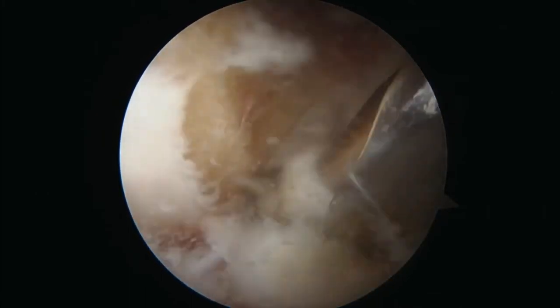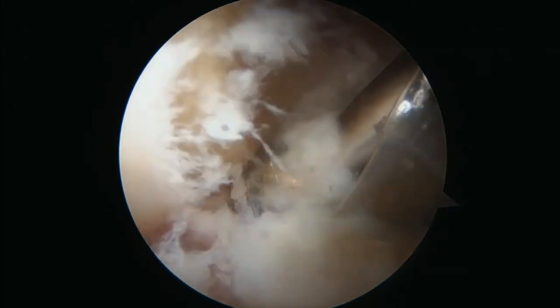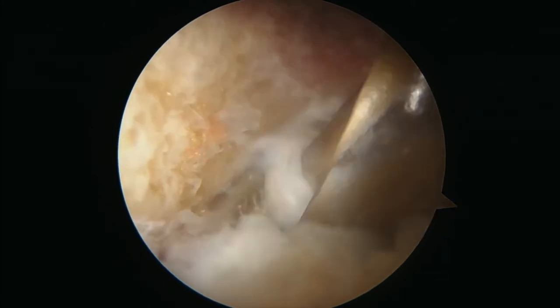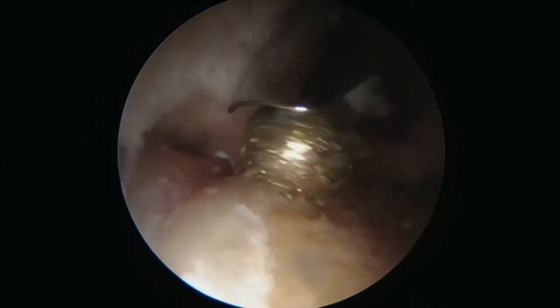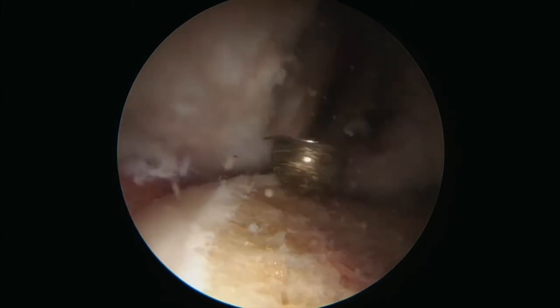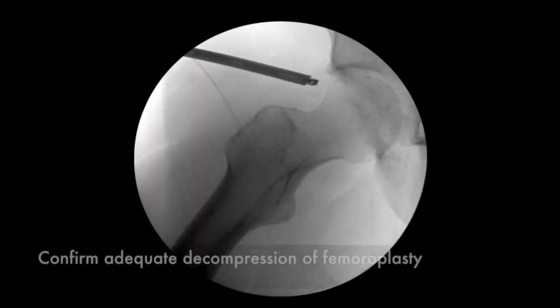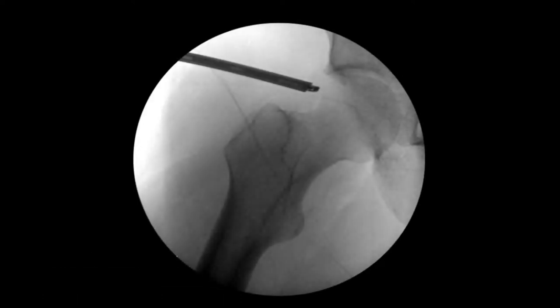The vessels should be identified both anteriorly and posteriorly to ensure there's no compromise of blood flow. It should be noted during femoroplasty that some bone may be very hard and sclerotic requiring some force to remove, whereas some bone may be quite soft requiring very little force. After the femoroplasty, the head and neck junction is carefully scrutinized to ensure there's no residual cam-type deformity. The labral seal is also evaluated. Under fluoroscopy, we confirm adequate decompression of the cam deformity.